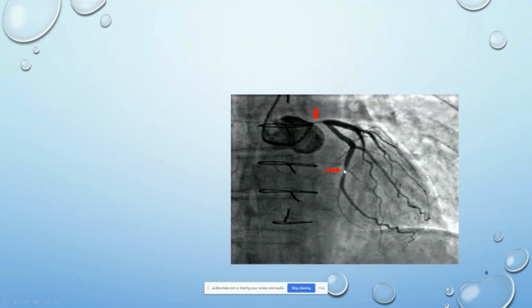Wherever it's thin, the negative space, like this gray area, is because that space represents plaque or atherosclerosis. Otherwise, it would be this big. So the small thinned out spaces are where the plaque is. So if they find an issue, then there are different things they could do.